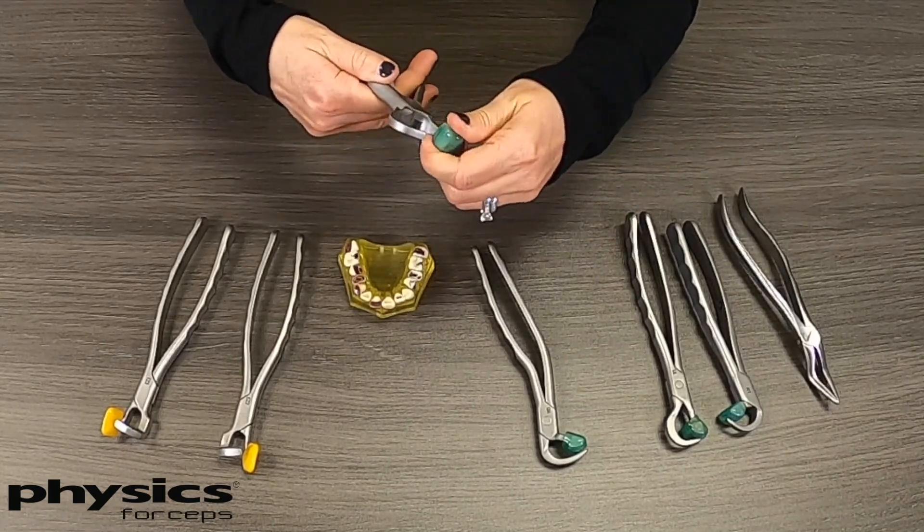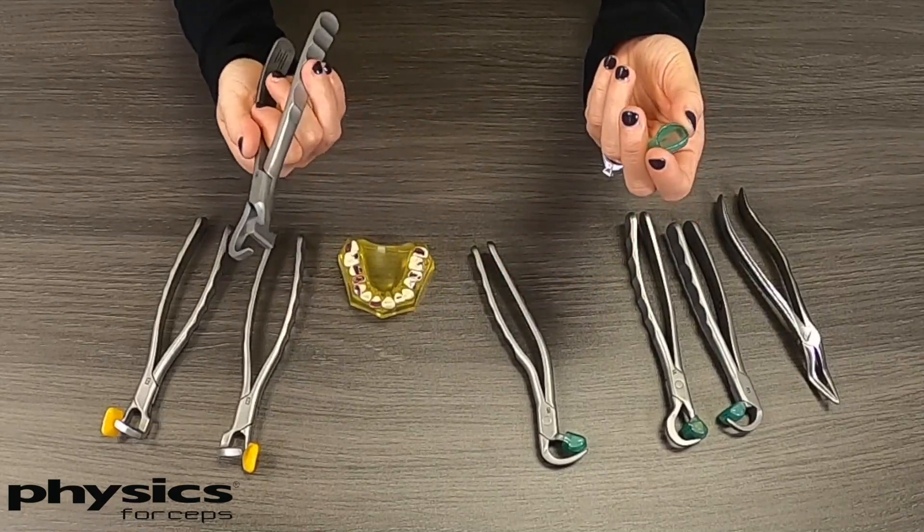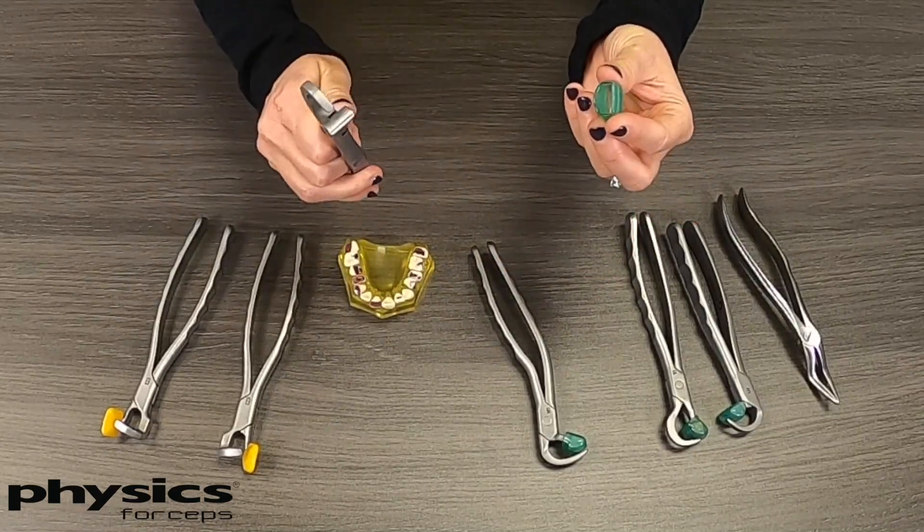After you're done with the extraction, you can pop the bumper off, place the instrument in your ultrasonic and then onto your autoclave, and sterilize without the bumper.